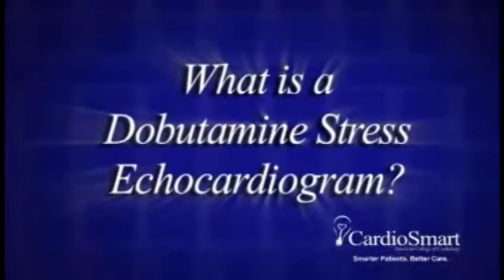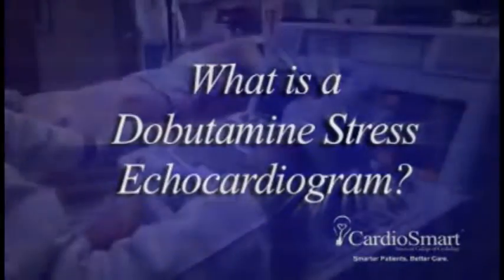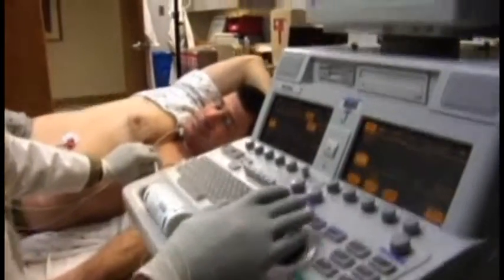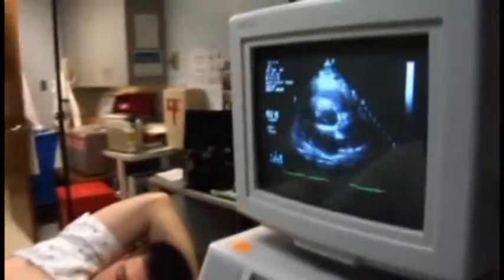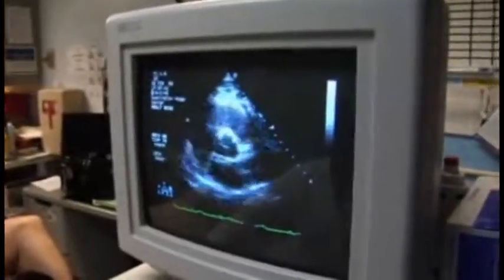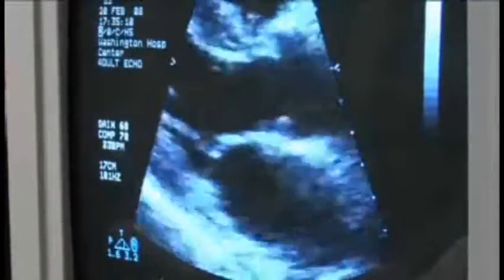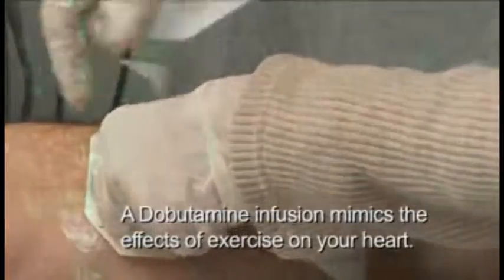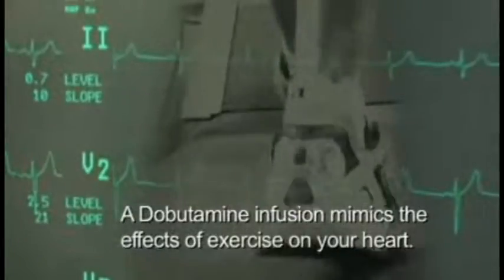A dobutamine stress echocardiogram is a test that uses high-frequency sound waves, or ultrasound, to examine the heart's anatomy and function. Infusion of the drug dobutamine mimics the effects of exercise on your heart by increasing the rate and strength of its pumping action.